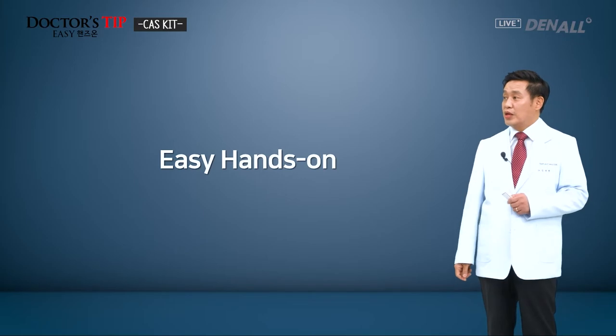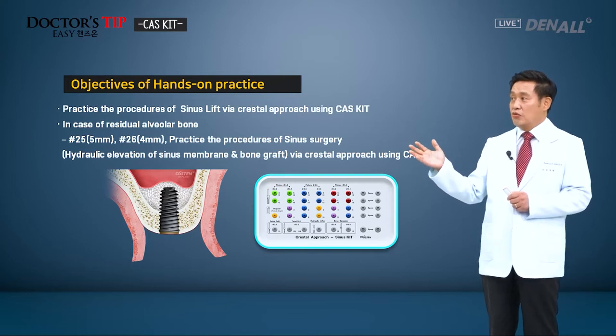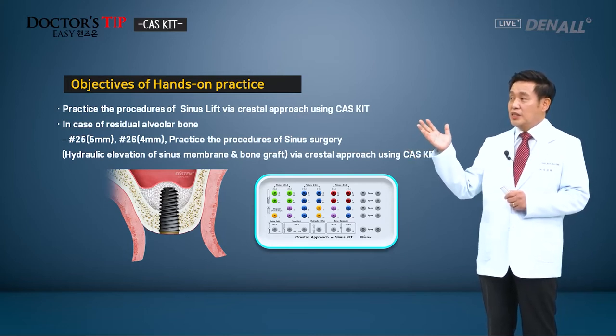Next, easy hands-on. The objectives of the easy hands-on. On the model, CAS kit will be used.